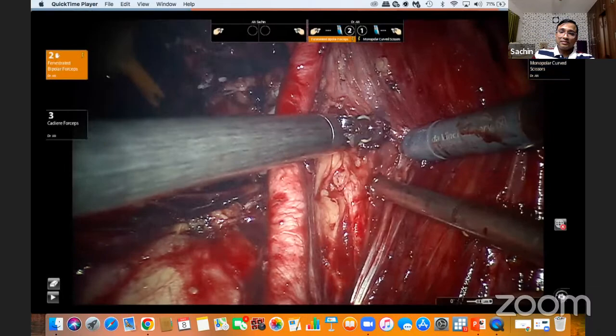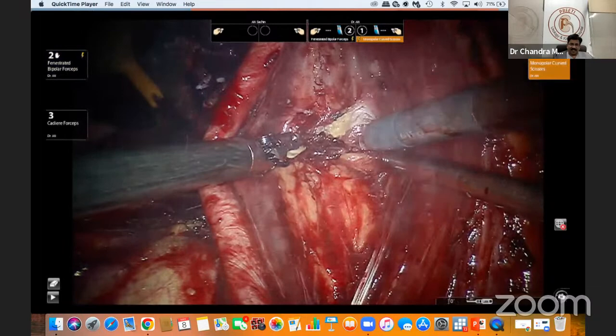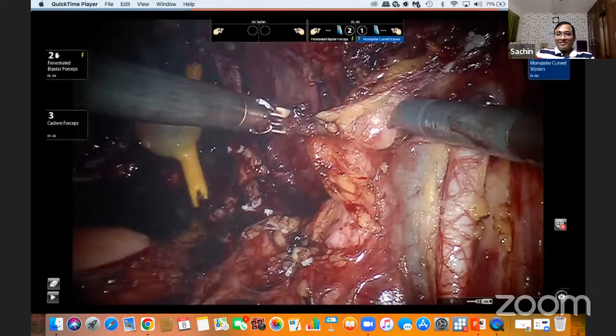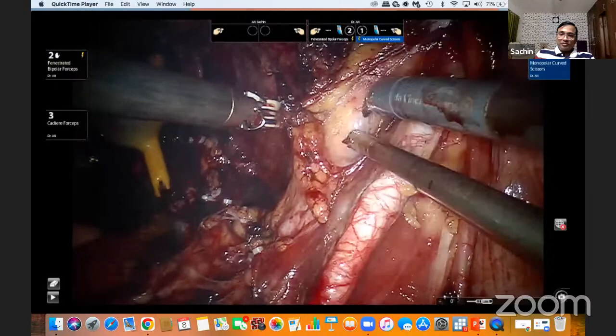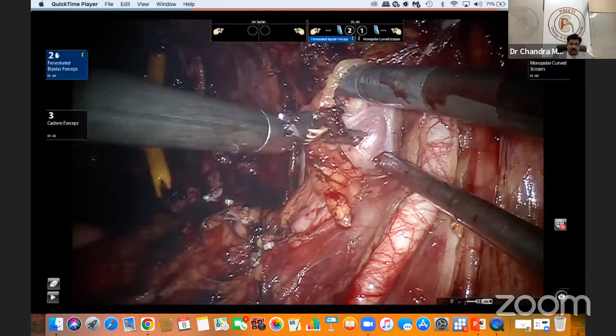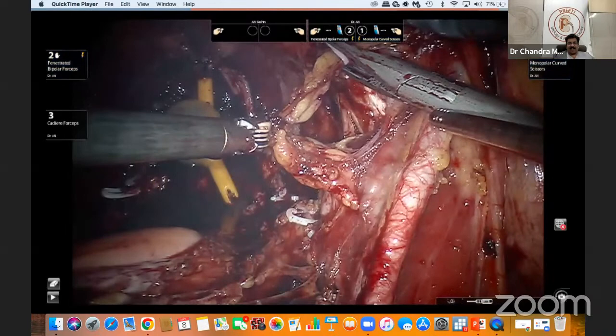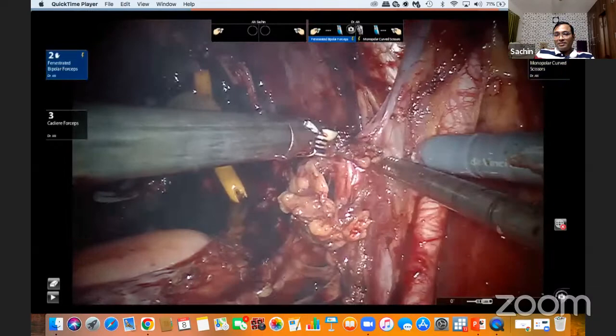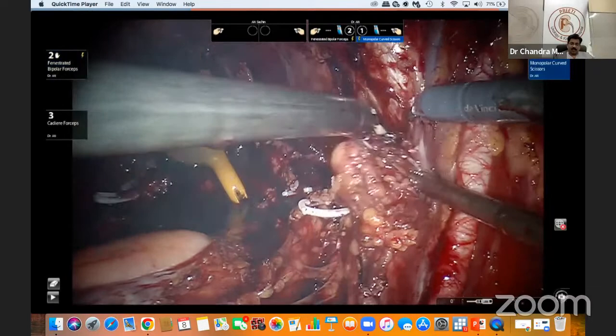In your hospital now, Aster, who is your assistant? Sorry to ask. So my assistant is my colleague from Medanta who has joined. Okay, right. He's Dr. Akbar. He has some experience with robotic surgery also. For them, it's a little bit taxing to sit for a long time and do all this, no? Yeah. But for the surgeon himself, it's taxing. So some places they do the cystectomy with one surgeon and the conduit is done by another surgeon, two team surgery. So definitely it improves the performance.